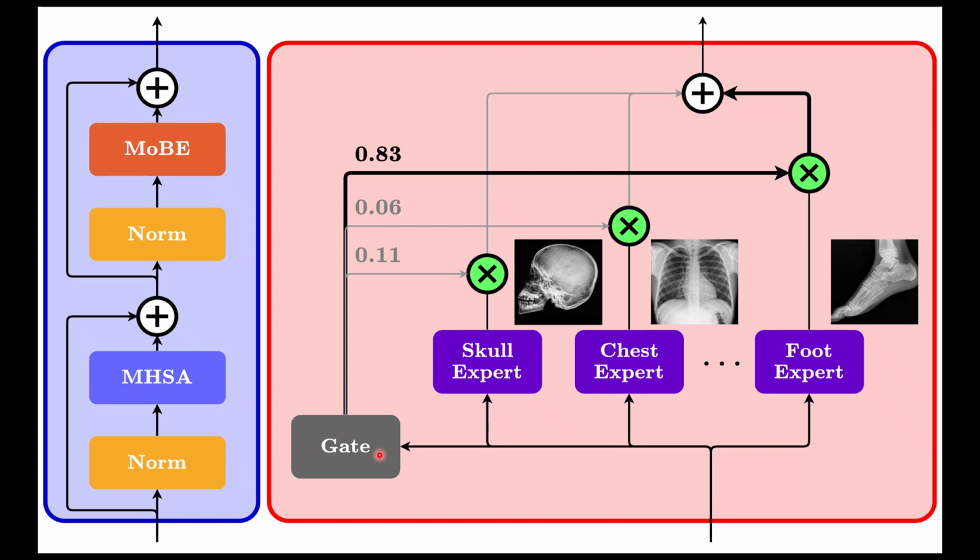This architecture, combined with a carefully curated dataset where an LLM extracts body part specific text from radiology reports, gives you a model that genuinely understands pediatric imaging across anatomy, not just chest, everything. It outperforms every prior VLM in both zero-shot and fine-tuned settings, including rare conditions like pediatric inflammatory arthritis, which almost no prior model even attempts.